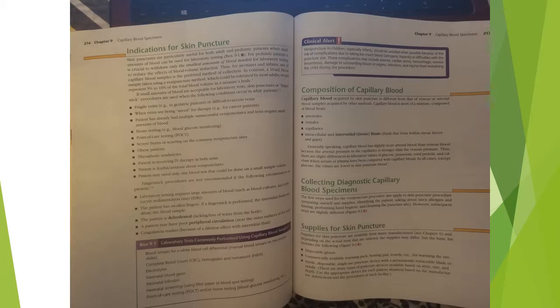Box 9.1 shows laboratory tests commonly performed using capillary blood samples. Blood smears for white blood cell differential, manual blood smears on microscope slides, complete blood count, hemoglobin and hematocrit, electrolytes, neonatal blood gases, neonatal bilirubin, neonatal screening using filter paper or blood spot testing, point of care testing, and/or home testing.